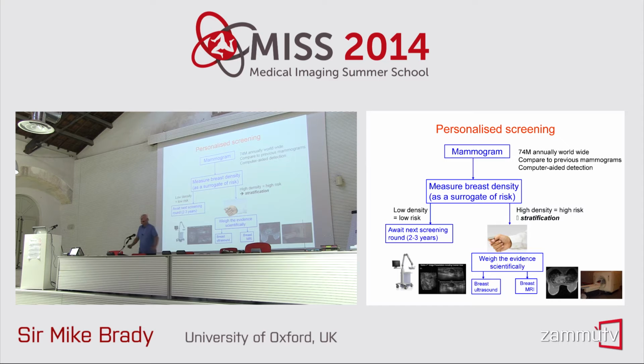You might think I'm a little ghoulish, but for the last 29 years, my wife has had a mammogram every 2 years, and I've kept those mammograms, and I've made a movie by doing deformable registration. So I can watch a movie of the evolution of my wife's breast over that time. You might think that's a really, really weird porno movie, but actually, there's a very, very good reason for it, and I'll come on to it in a minute. Okay, well, low density, unfortunately she's had low density today, you just wait.